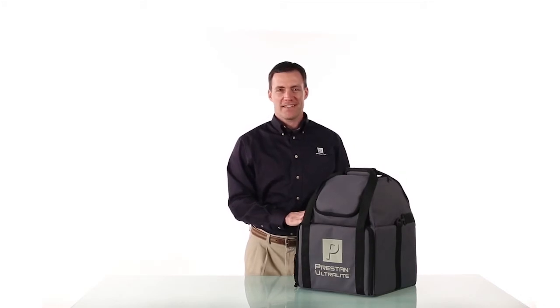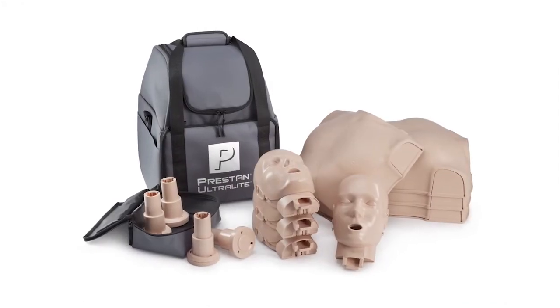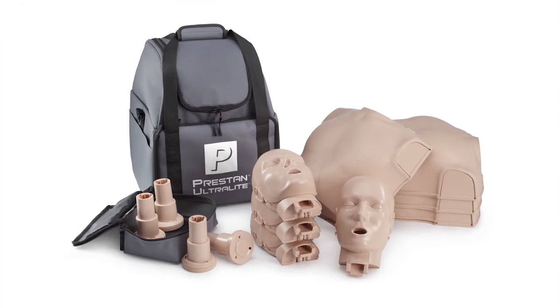Introducing the new Preston Ultralight, a compact, very portable set of mannequins with the same durability and realistic look that you come to expect with Preston.